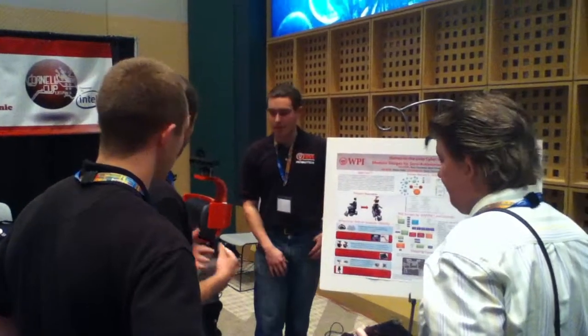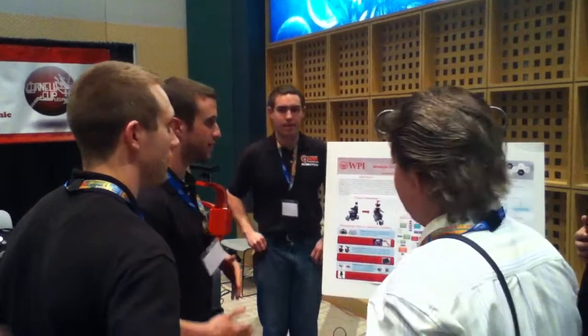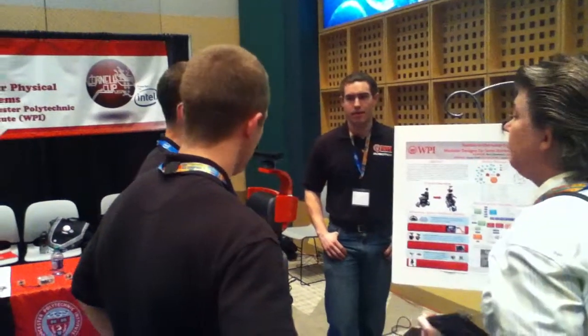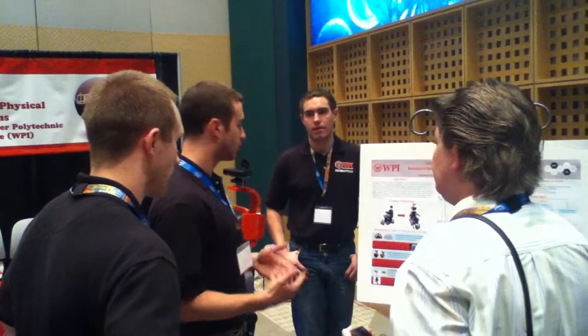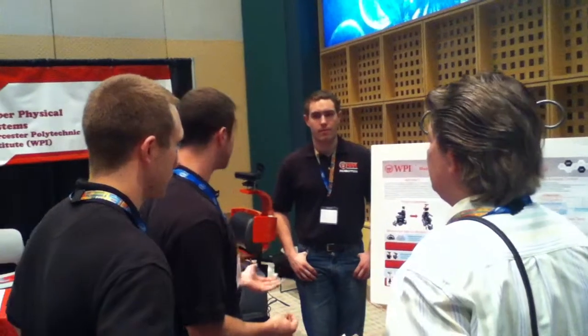Okay. So then the other thing is, how did we come to the solution? First of all, we had to identify our stakeholders and get their needs. Basically, we only really used 4 stakeholders for this. The locked-in individual inside the wheelchair themselves, and a couple of different ones. One that we wanted to specify was different robotics engineers, because we wanted to build subsystems that would subsidize the cost of the overall system, such as the sensor.